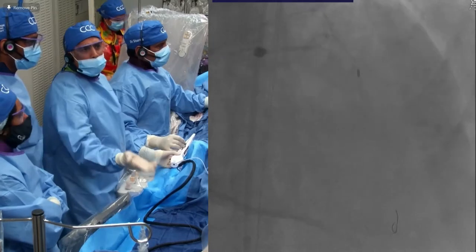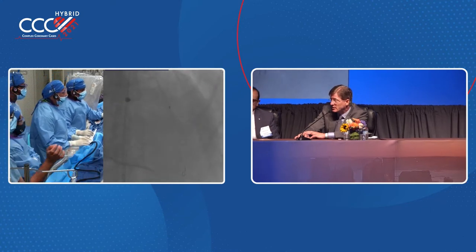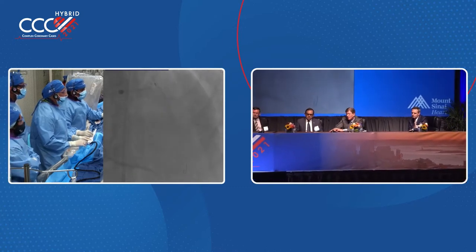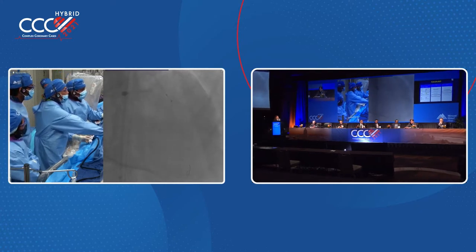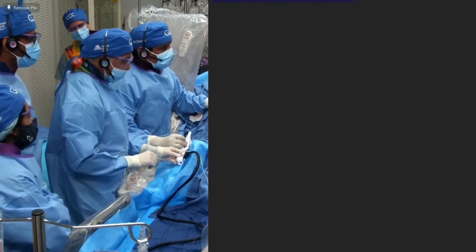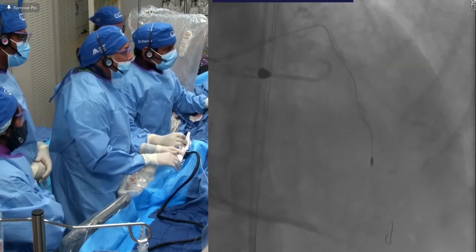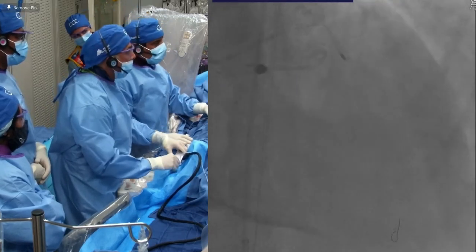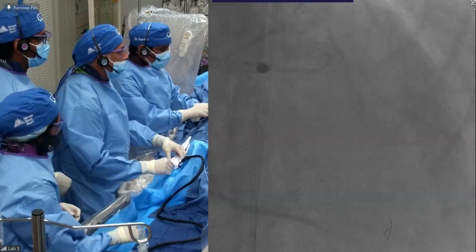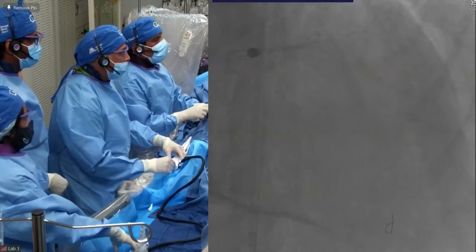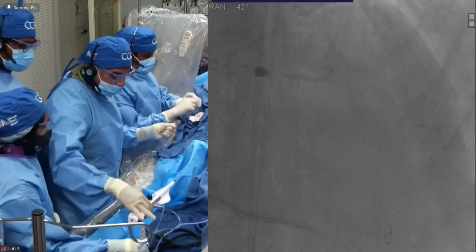On the other hand, it is also a group in which we have more complications, more prolonged length of stay, and more morbidity than in non-dialysis patients. This looks like pretty focal LAD disease. His pericardium would be very hostile. That right coronary injection - you saw a crescent of calcium across the lateral aspect of the pericardium on fluoroscopy, and I think that's indicative of likely fusion of the epicardium and pericardium, so that opening the pericardium to get to the LAD can be a two- or three-hour endeavor. If this were me as a patient, I would want Dr. Sharma to put a stent in my LAD.